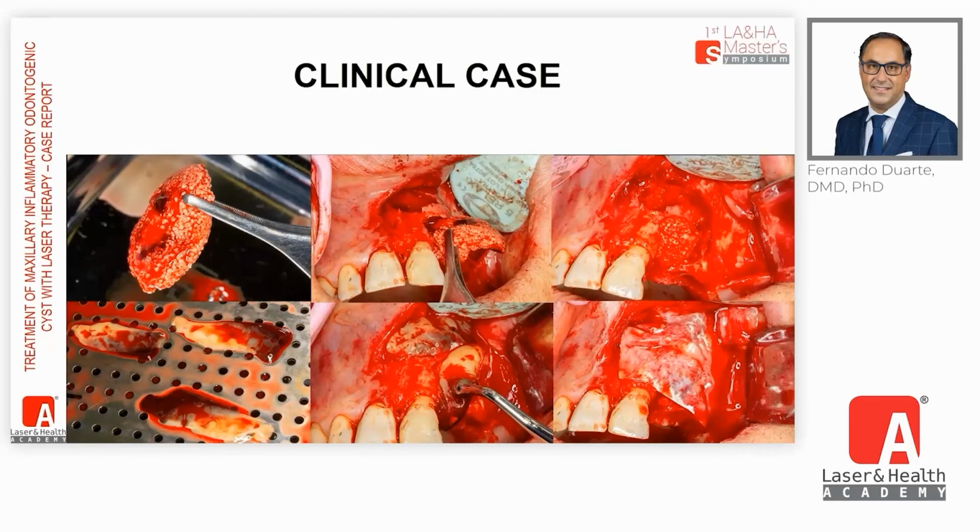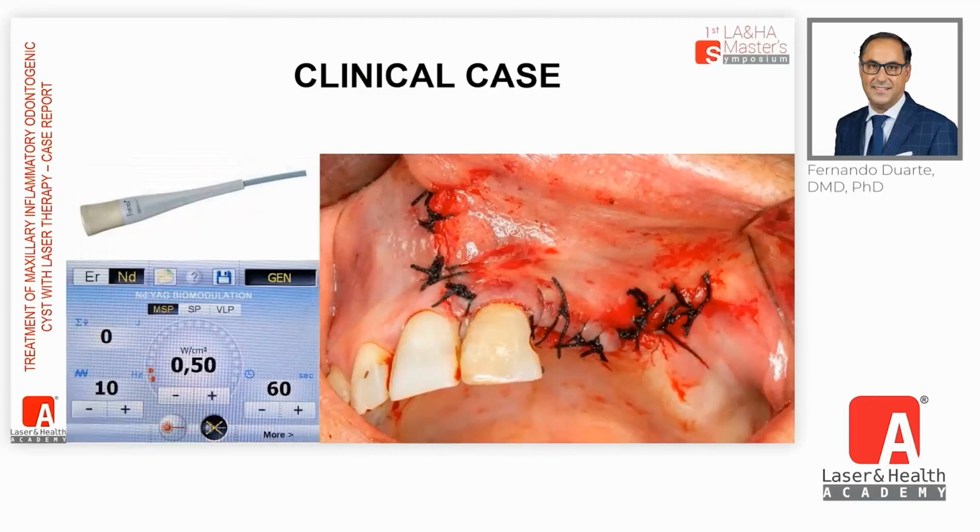Now, bone reconstruction, the sticky bone. As you know, for the fibrin protocol, we can use the fibrin in 3 different ways. We mix it with biomaterial, and this is a sticky bone. We can use it as a membrane, or we can use it as a glue. And in this clinical case, we tried all 3 ways. On top of that, we put a resorbable membrane. And finally, the photobiomodulation. We use the Genova end piece with different settings and apply it after the surgery.